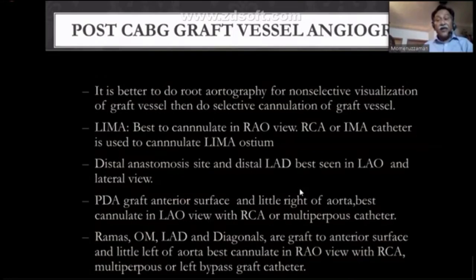Now, nowadays, we are getting a lot of patients for post-bypass angiogram, and anatomical identification of the blockage. In general, before doing angiogram of the graft vessel, you must know the surgical report of that patient, where the graft was done. It is written in all surgical notes: LIMA to LAD, saphenous graft to PDA, OM, and so on. Detail is there. So you must know whether it is three graft or four graft before entering the cath lab.